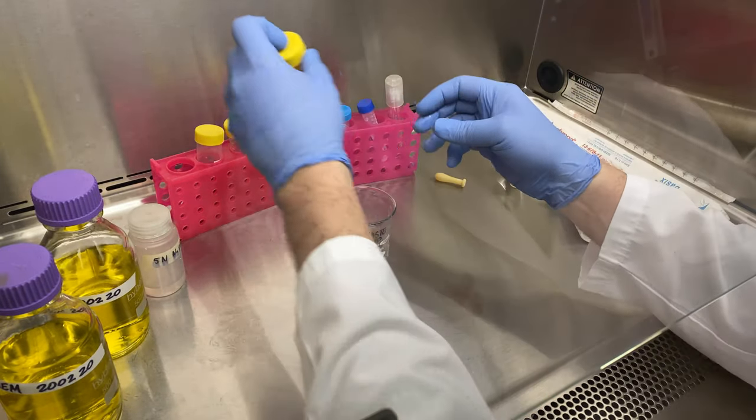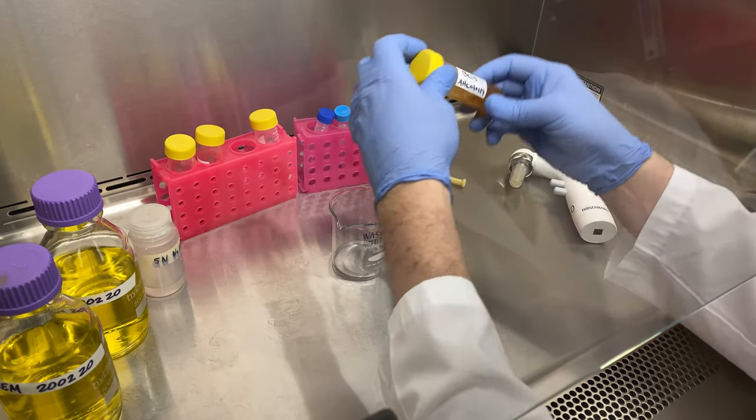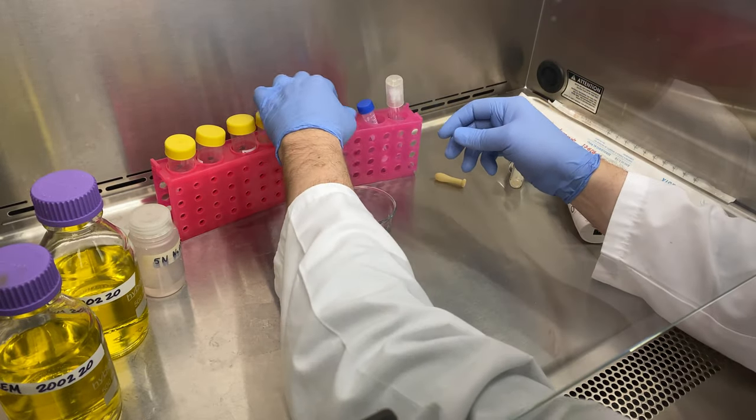The hood has been set up and sterilized. We've placed all of our components inside. We loosen our caps and mix our solutions before we get started. Remember, loosening the caps will help you to open the caps with one hand.